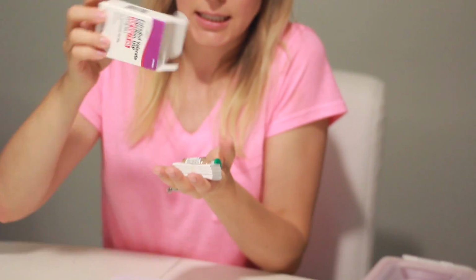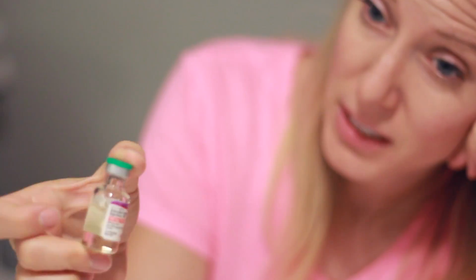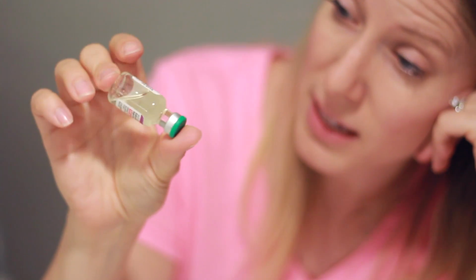Now, the thing I've been dreading, and I'm just avoiding it at all costs. So I'm going to be taking estradiol valerate. And for my protocol, I'm going to be taking 0.2 mLs every other day. So for right now, that's my dose. Okay, here's the problem, guys. I heard progesterone is a little thicker, but this is still an oil. So it's all mixed. I don't have to mix anything or do anything. I just have to draw it up and give it.